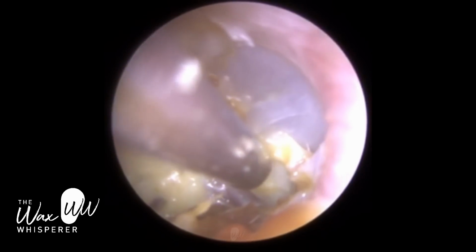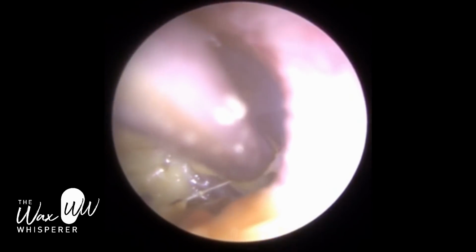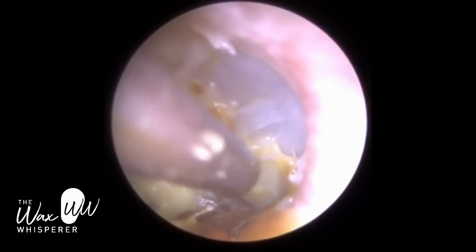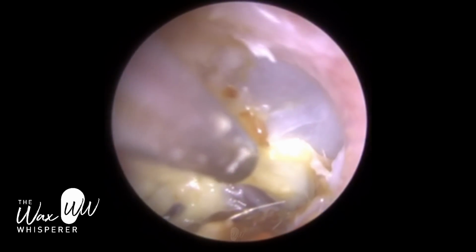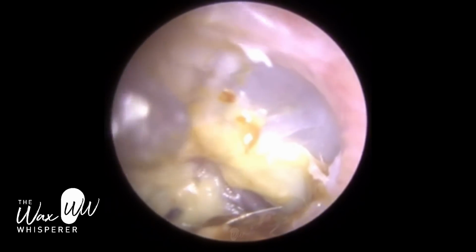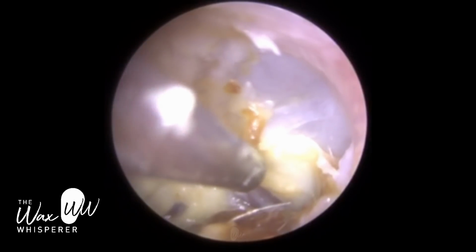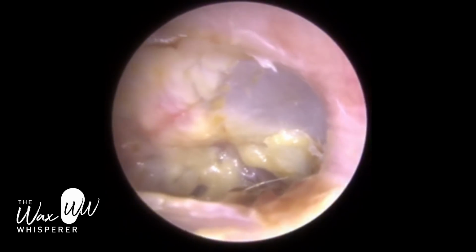The contralateral ear, so the opposite ear, don't do the same night. Do that the following night, because if you do that straight away, when it comes to draining your second ear, some of the drops in the first ear may seep back into the ear canal, and alongside it some earwax. So that's just a little tip, guys. And excessive use of drops can make the skin really wrinkly in the ear canal. This is what's happened in this case.